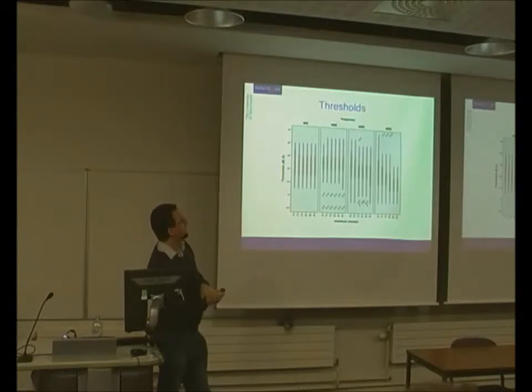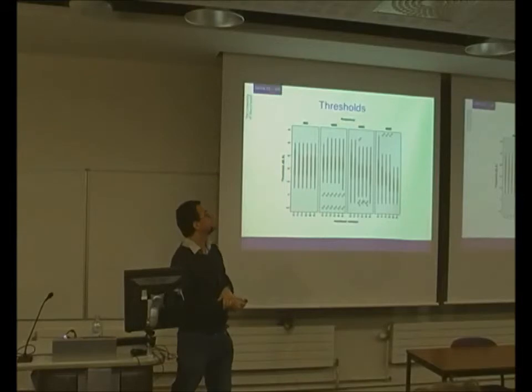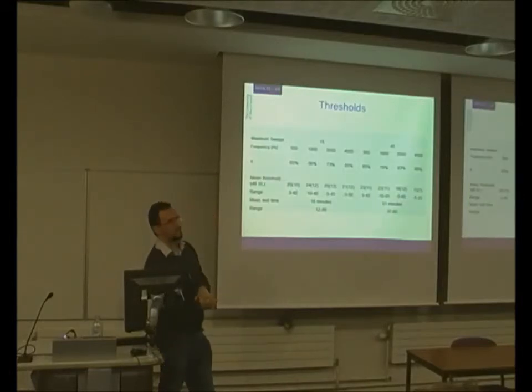Okay? And it's a similar picture for 2 kilohertz, but the lower frequencies look fairly similar. And the range of thresholds you'd expect for 15 sweeps is quite large, and it does get a bit narrower as you increase, so there's a bit less variability, which represents the lower noise. Oh, and I should mention these thresholds are converted to sensation level. So here's that data again, just with some numbers, which you can look at later if you want.